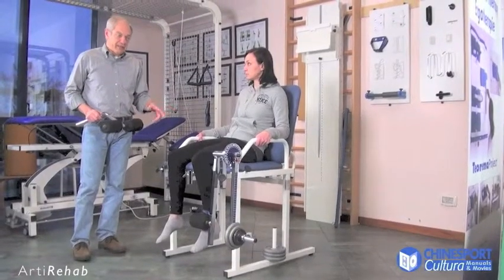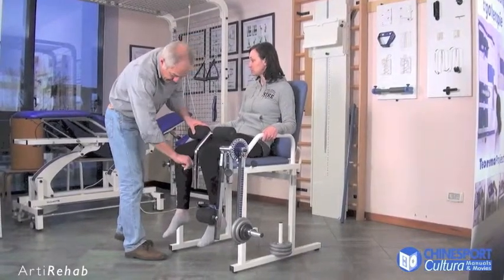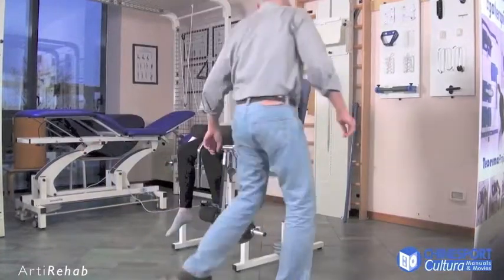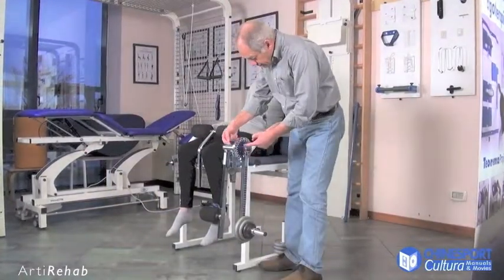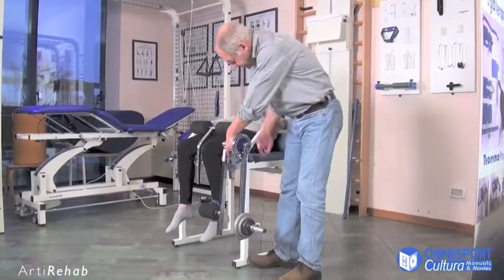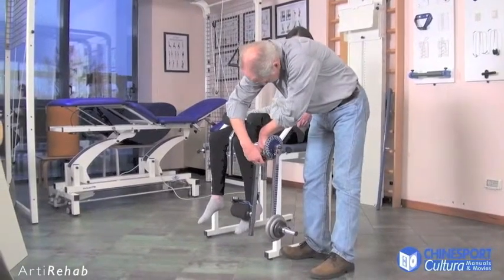Once the patient is sitting on the machine, first of all, the thigh must be secured so that the knee stays still at all times. The rotation axis for the moveable arm can then be aligned with the axis for the knee by adjusting the height and depth of the moveable arm.